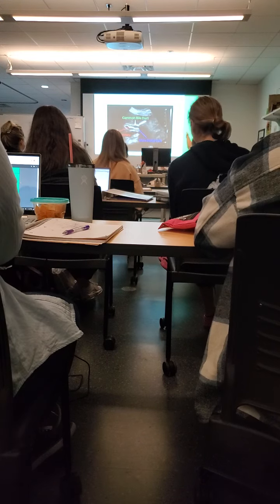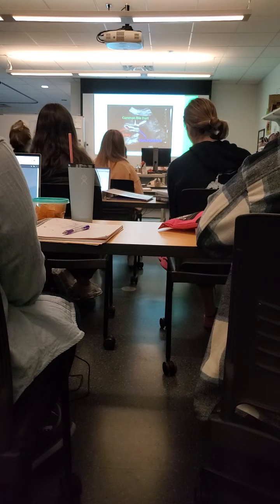Okay. So if we turn, this is what it's going to look like. So now we're in a sagittal plane.